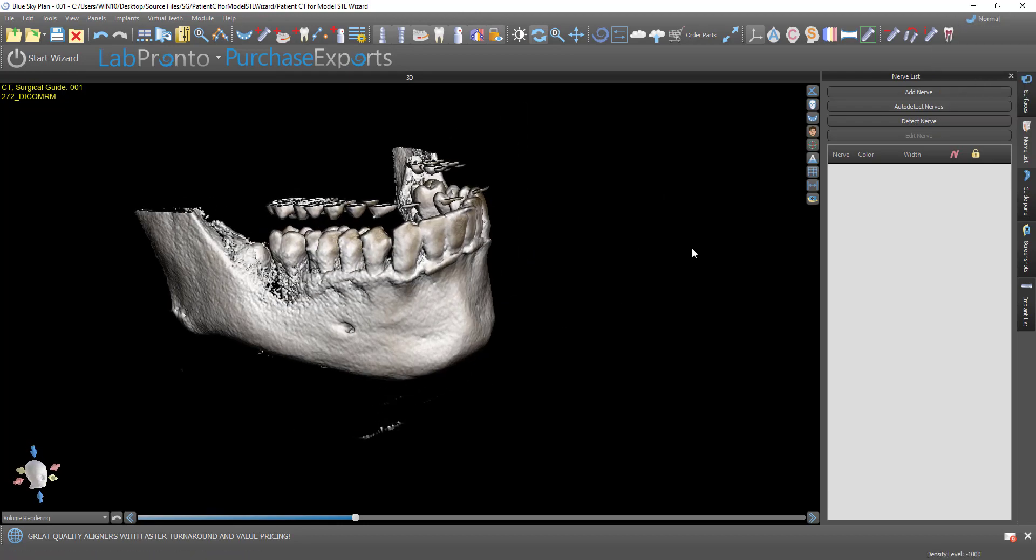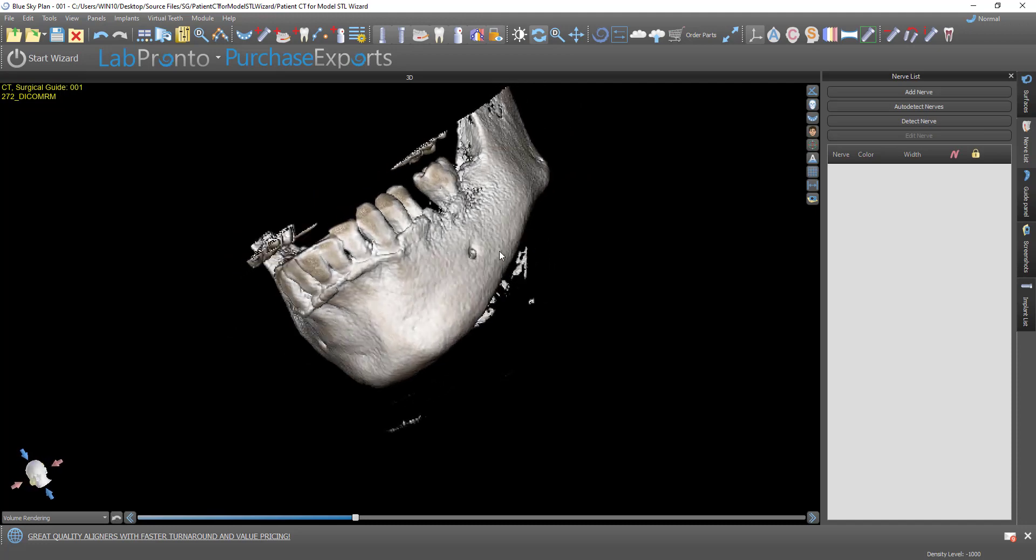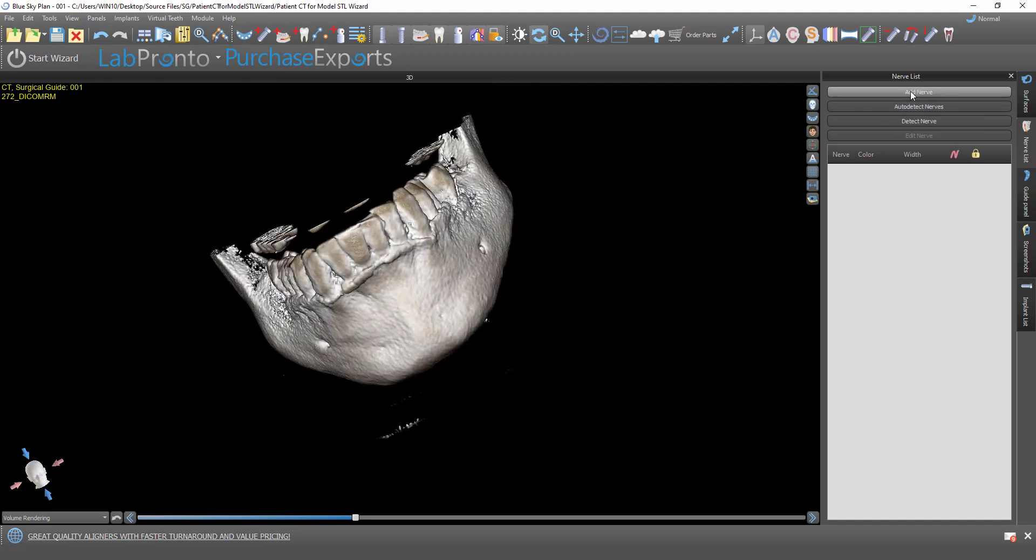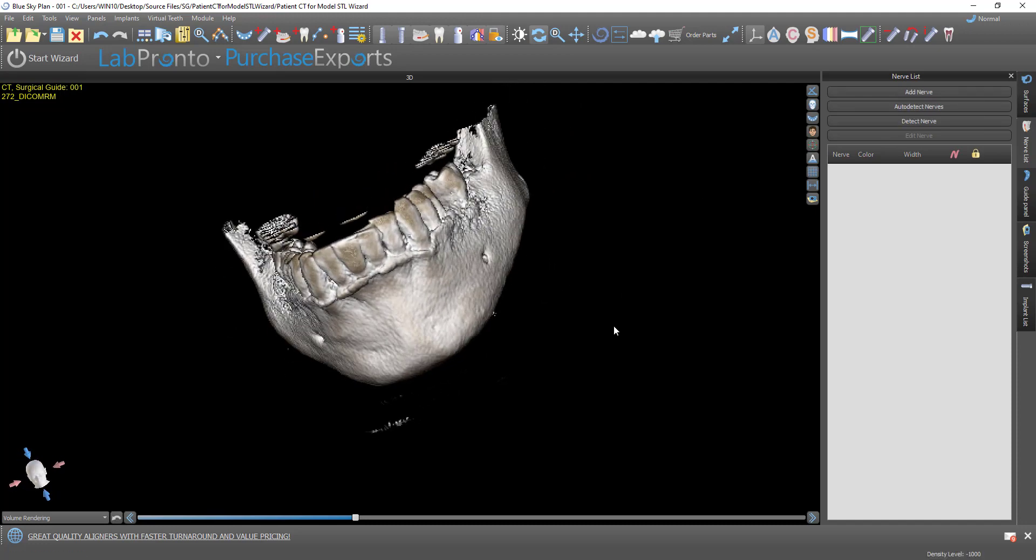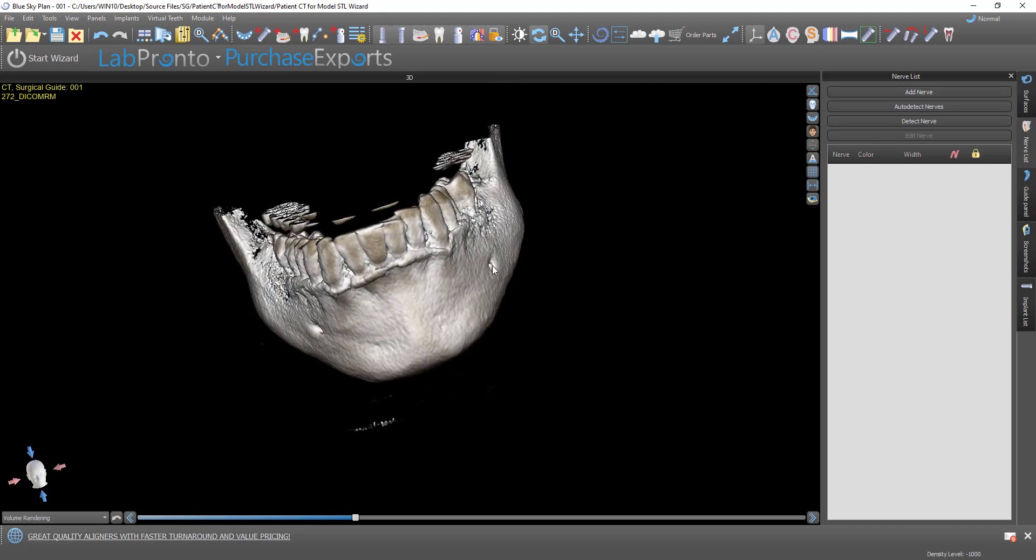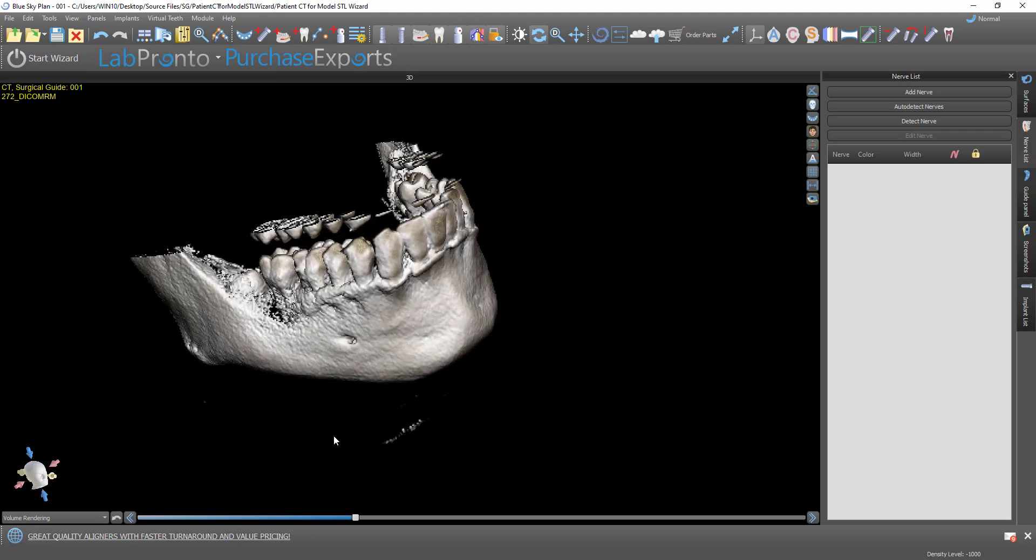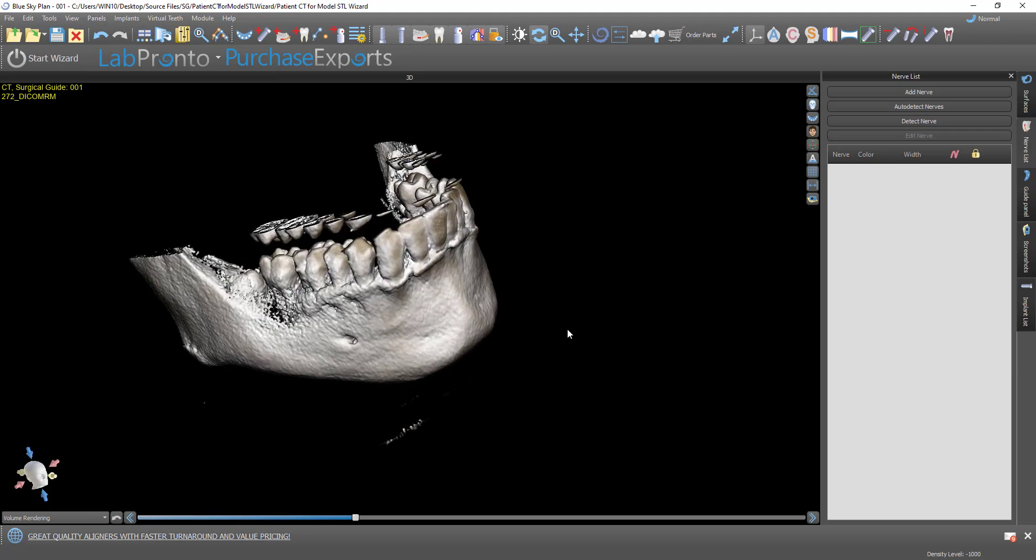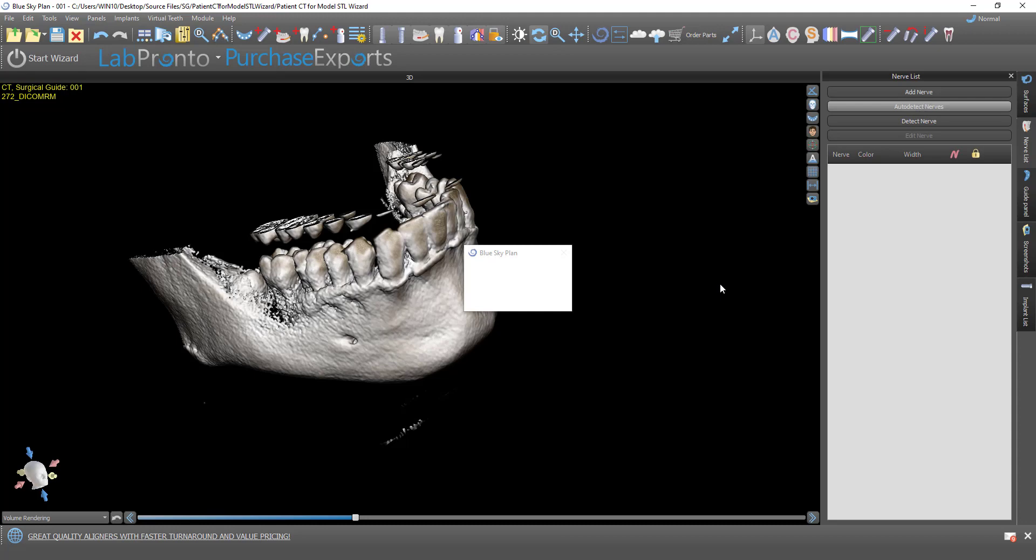We have our Nerve Detection panel. And we could use the previous functionality of Add Nerve if you want to click once on the entrance to the nerve canals. But we've kept that functionality, but we've also added the Auto Detect Nerves button.